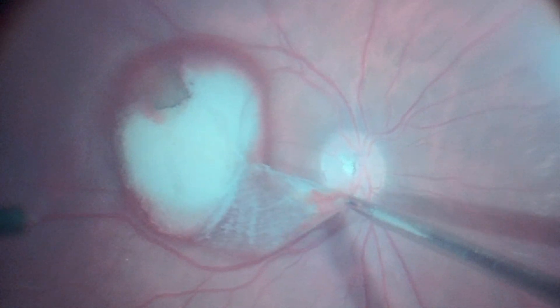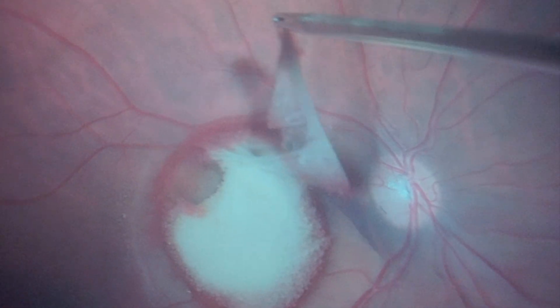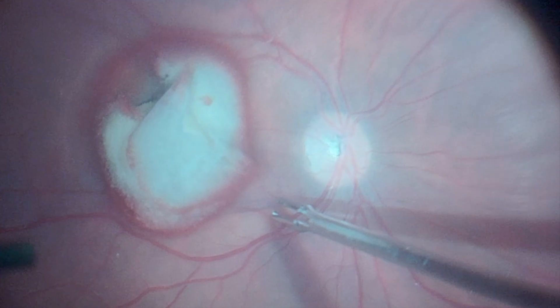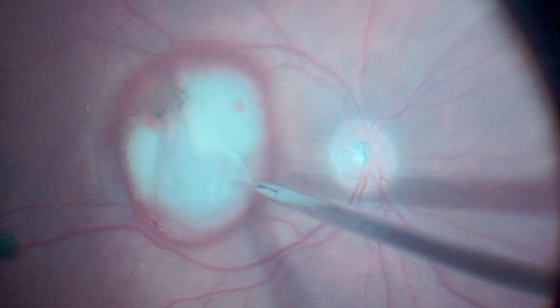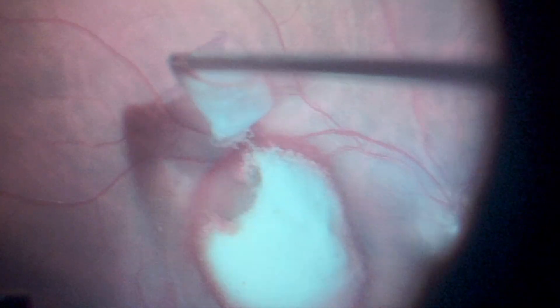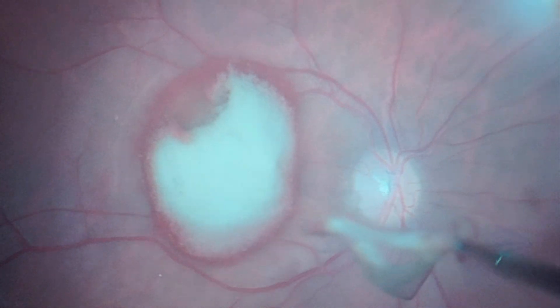Preoperative evaluation of these cases with optical coherence tomography is essential to determine the location of the preretinal hemorrhage. Vitrectomy is the treatment of choice for cases of Valsalva retinopathy with sub-ILM hemorrhage, since blood reabsorption is generally slow and hemoglobin catabolites can be harmful to the retina, compromising the visual prognosis if a conservative approach is chosen.